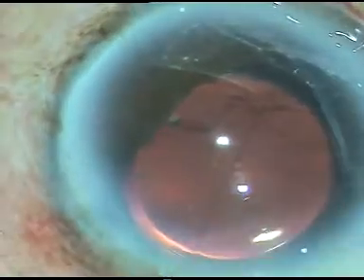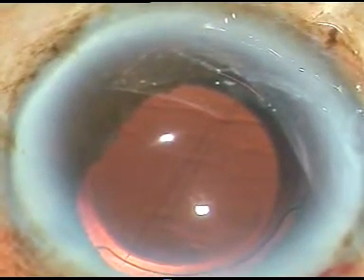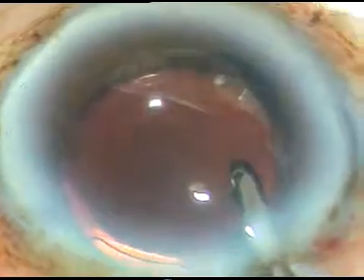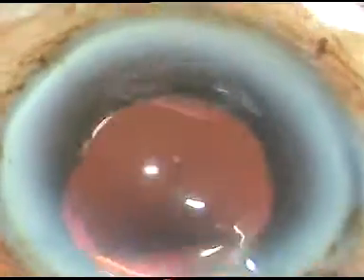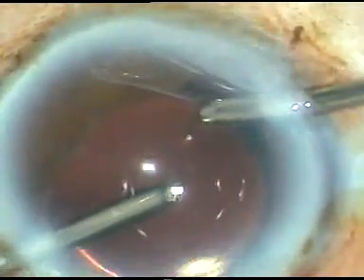This is just a cosmetic step. Sometimes this thread-like iris tag can come into the visual axis and may cause some problem. So I thought in this case I will trim the pupillary margin there, and now it looks nice.